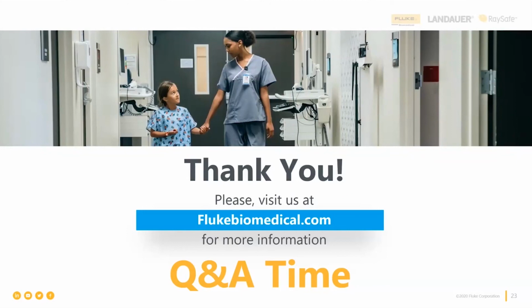AEDs either have just one energy setting, or they may have two, some may have three different energy settings. Their firmware typically will start with the lowest energy setting of the two or three, and then increase if the first discharge does not convert the patient back to a more normal rhythm. That's the way those work, and they're built in. What you have to do is not allow them to have a converted waveform. You have to keep giving them the arrhythmia so that you can see that functionality increase the energy setting once or twice or three times during your testing to make sure it's going to work.